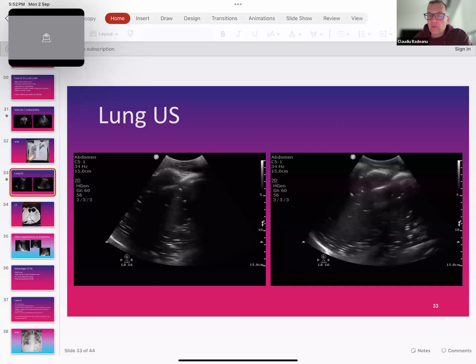Coming back, we discussed today about normal lung ultrasound, and we talked about comet tail, A-line, and the lung sliding. These are the 3 things to look at when you do the scan. And we talked about the A-line. You see that parallel to the pleura. A-line is a line parallel to the pleura. Okay, but it is an artifact, so it is a reflection of the pleura, actually.